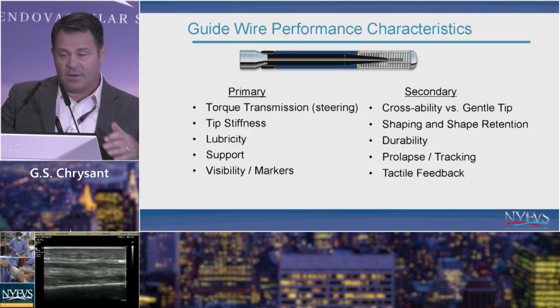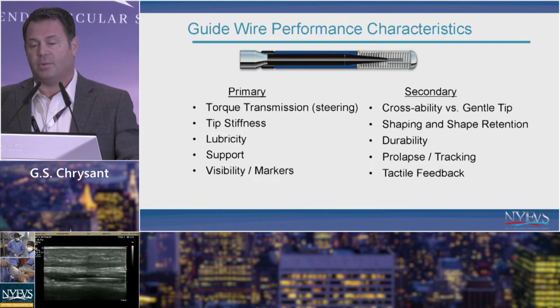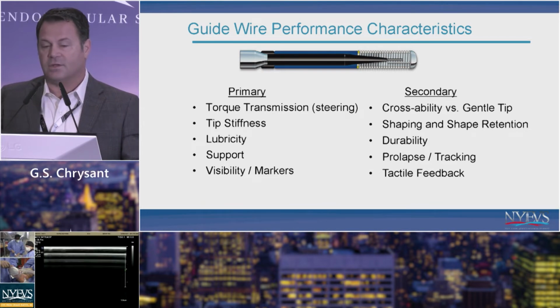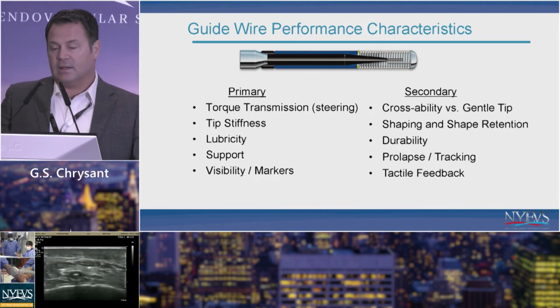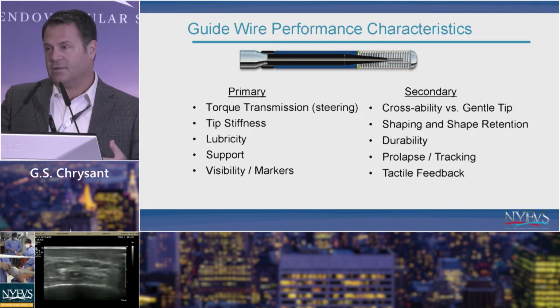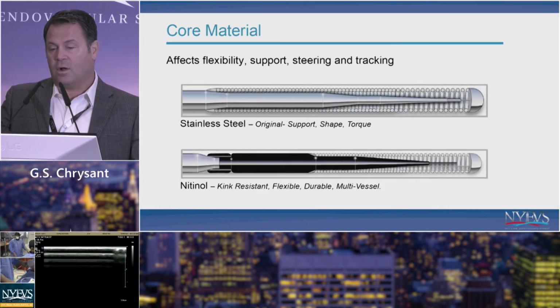So the first thing that you're going to want to deal with are wires, and I think a very important thing to understand when you're picking equipment is understanding the wire and its performance characteristics, and we'll get into that a little bit later. But you want something steerable, you need something that's stiff, you need something that's slick that can get across some of these lesions, and then sometimes you need features in the tip in terms of shape retention, sometimes you need it to prolapse. There are a lot of different qualities in these wires that are important, and understanding the core material is also important.